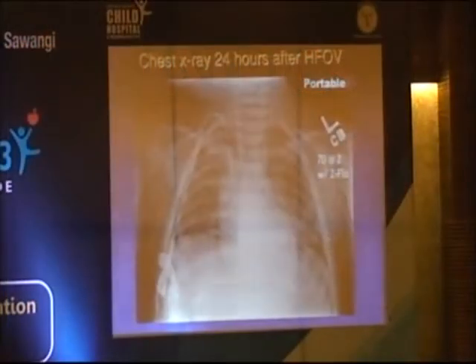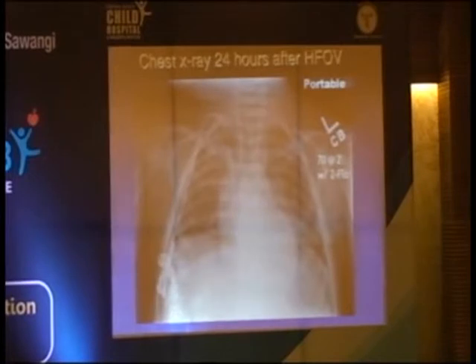We note that the patient's chest wiggle was pretty excessive. What would you do at that point? Reduce delta P, that's what I would do. And I would do that until you get a chest rise that's not too excessive, and then you may or may not decide to get a blood gas after that.